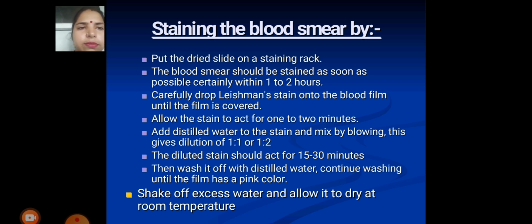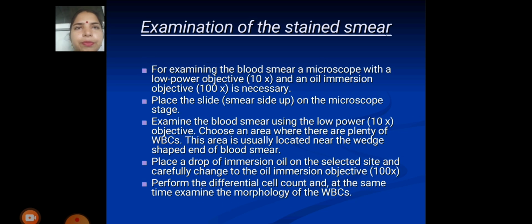Then wash it off with distilled water. Continue the washing until the film is pink colored. Shake off excess water and allow it to dry at room temperature. Examination of the stained smear.